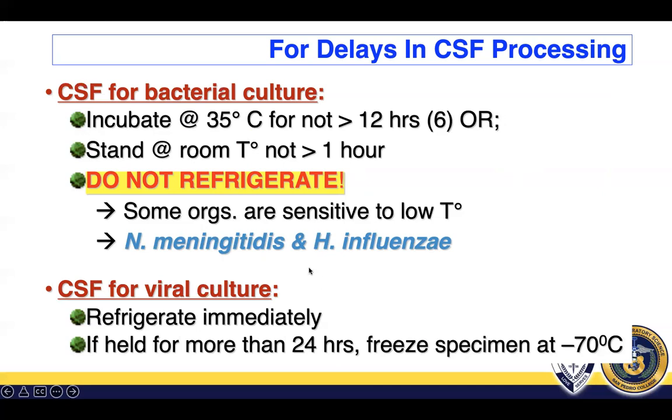meningitidis and H. influenzae. They're quite sensitive to low temperatures. They might die when you refrigerate the specimen. Okay. Now for viral culture, there's actually no problem. You can refrigerate your specimen.